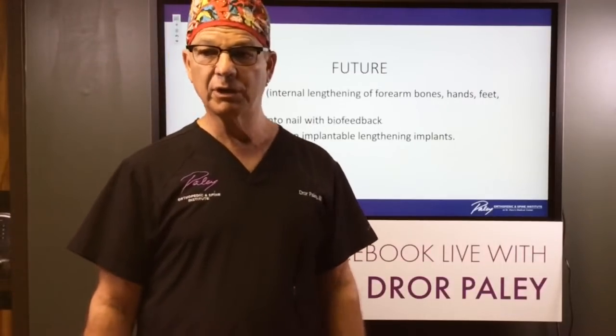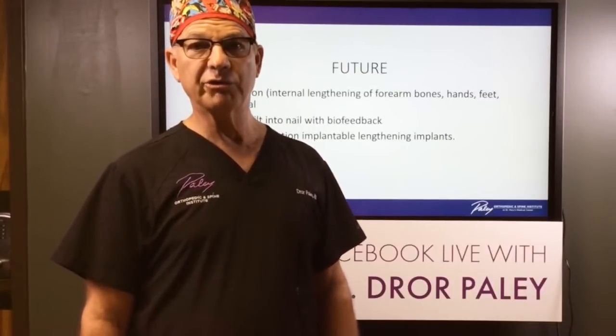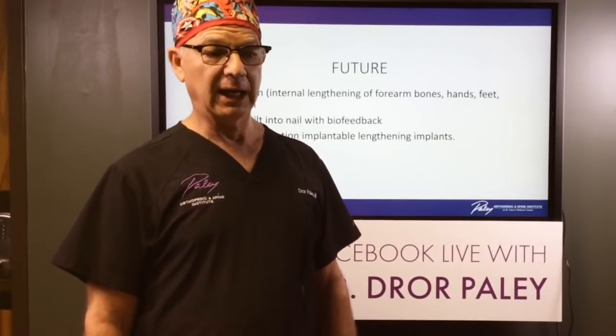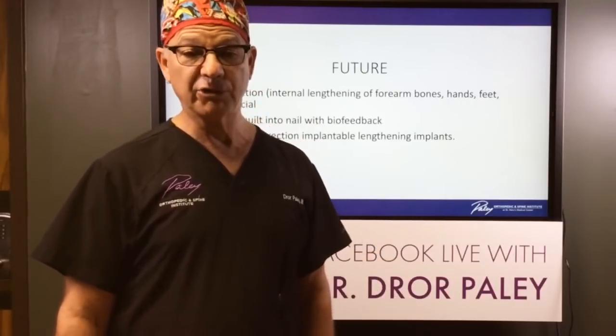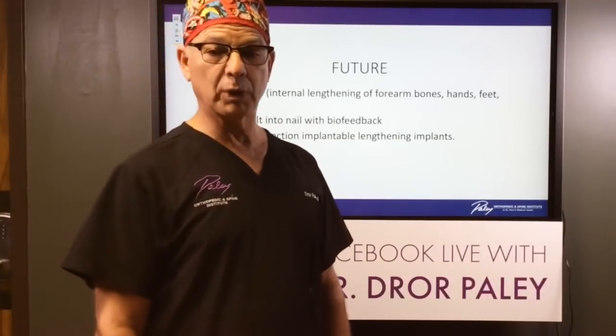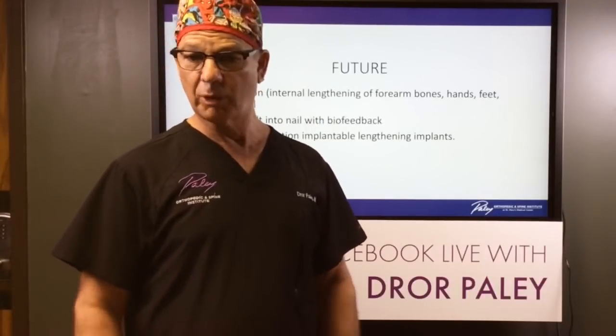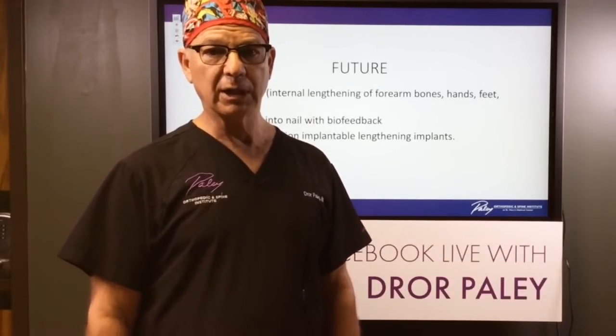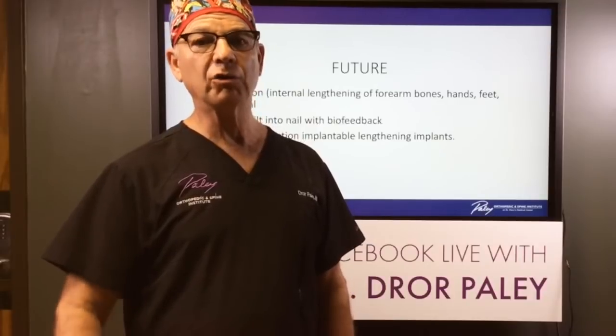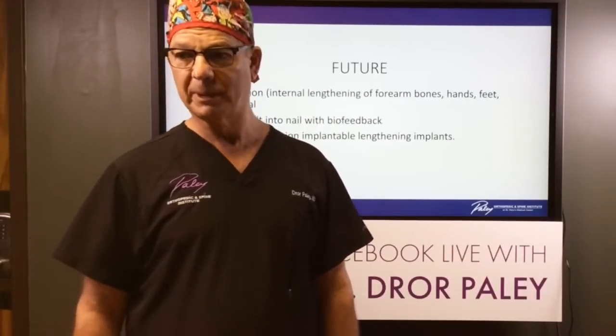We've used the implantable nails in pseudoachondroplasia, and actually quite a good number of them, after the deformities have been corrected. So it is possible. The other question was about the diameter of the bone. So that's not any more challenging in pseudoacons than acons or others.